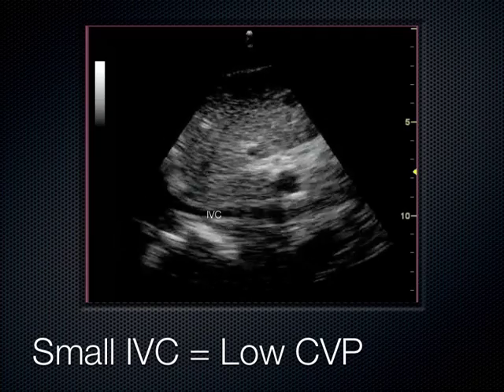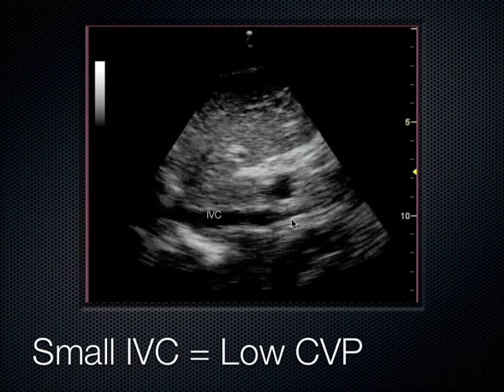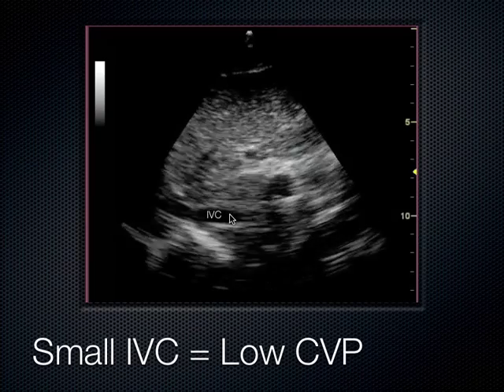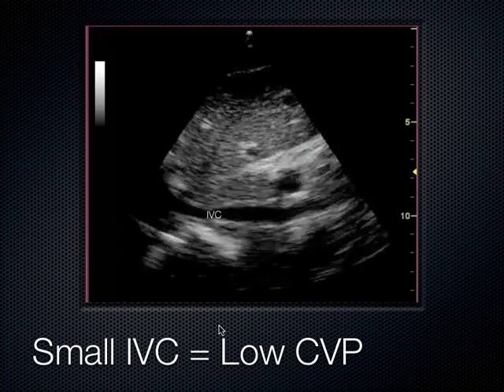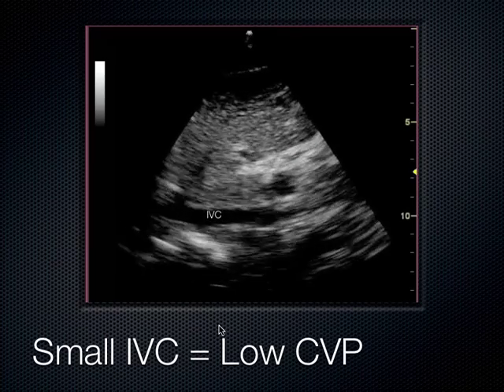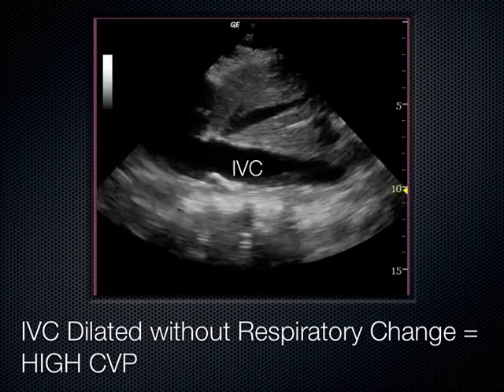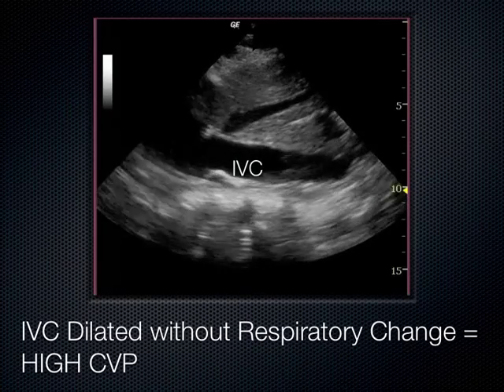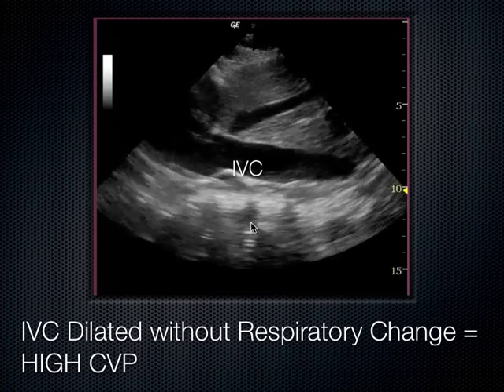Here's one that's a really small IVC that, as they breathe in, collapses down. We can see this collapsibility going on. As they breathe in, it just completely obliterates. So that's a really low CVP. This is somebody where I'm opening up the IV fluids. Another example here of a dilated IVC, no respiratory change, high central venous pressure.